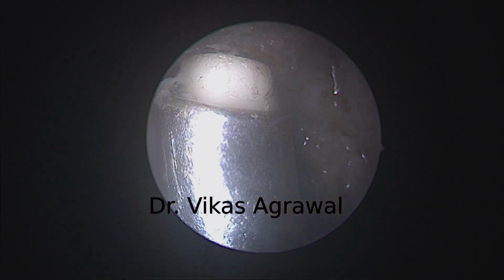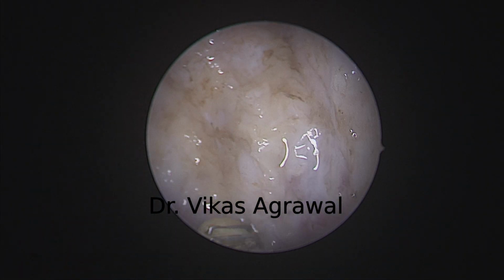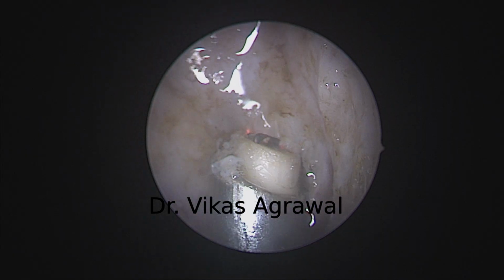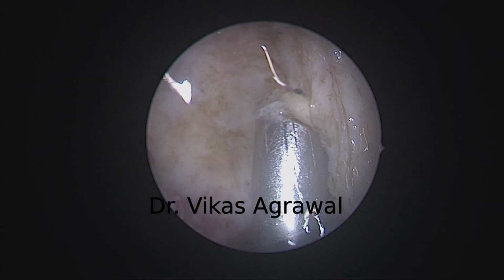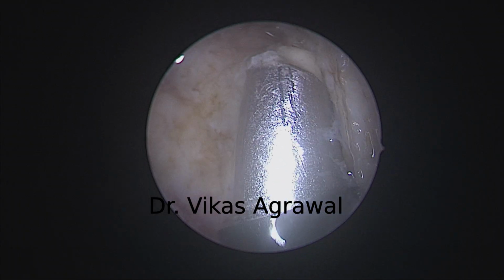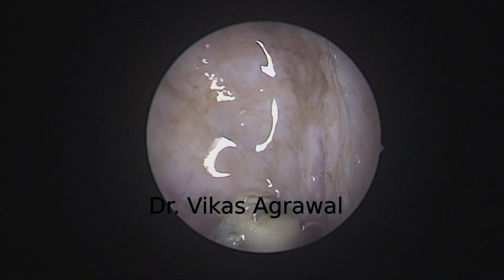Once you reach your boundaries, then as I said earlier, you will not get recurrences. So now I'll further define the buccopharyngeal fascia. That's the lateral boundary. That's the fossa of Rosenmuller completely cleared.